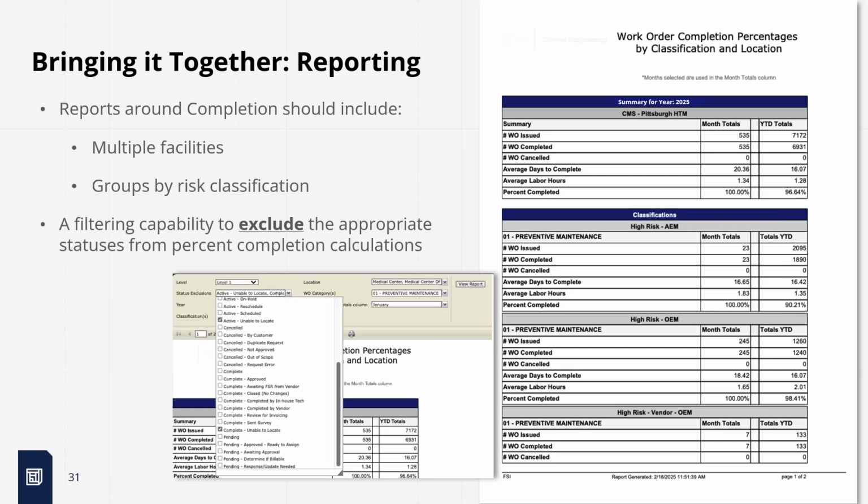Just in regards to unable-to-locate equipment, as far as the PMs that you excluded from the report, or the SLAs that are out there, or even the next PM date you gave, is all of that dictated by the policy for the hospital or by the accreditation? By the policy, it's more your policy.